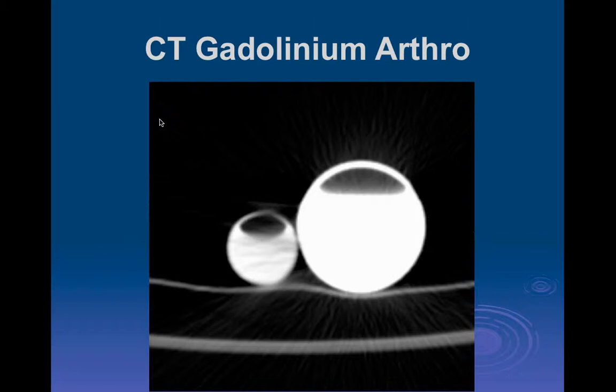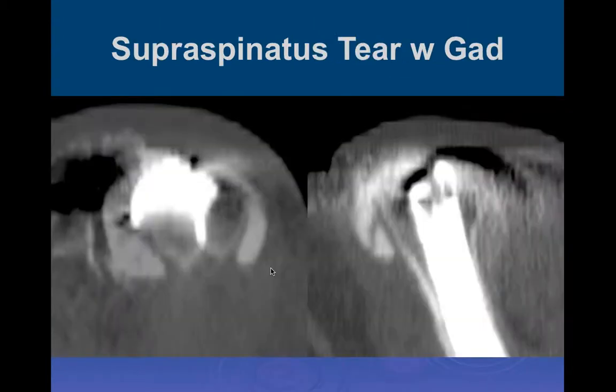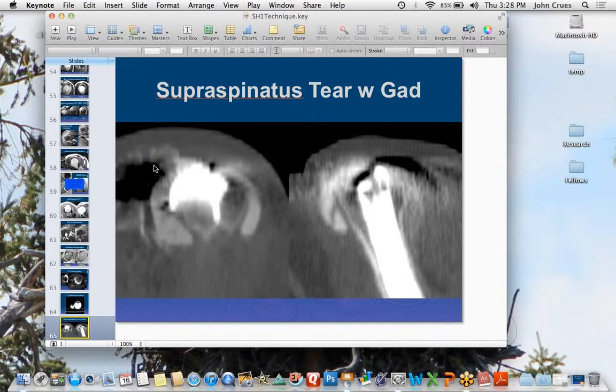So what do you do with that? This shows two vials in a CT scanner. This vial is with iodinated contrast. This vial is undiluted gadolinium. Gadolinium is actually dense on a CT scanner, and this is a case of a patient who couldn't have an MR scan and couldn't have iodine. This is a CT arthrogram using undiluted gadolinium, showing free flow of contrast into the subacromial subdeltoid bursa, showing that there's a complete rotator cuff tear, and this patient then went on to repeat surgery to correct that. So just remember that occasionally gadolinium can be used even in a CT scanner.